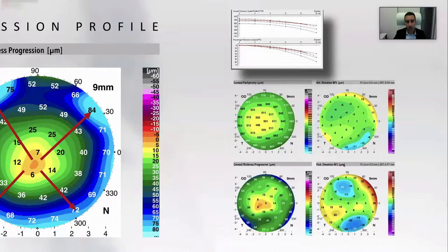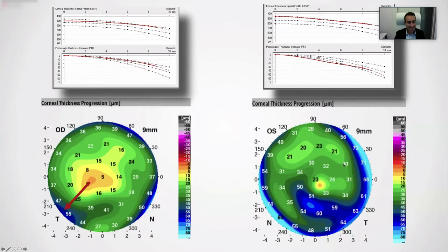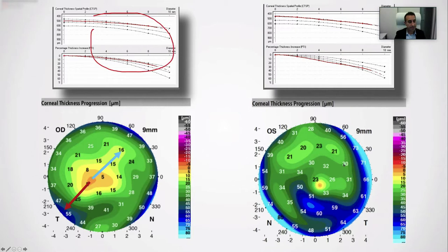Looking back at the same case, we see the Belin-Ambrósio Thickness Progression above, and the visual map below. In the right eye — the minimally involved one — you can easily see that the infratemporal thickness progression is much faster than the supranasal. This is hardly picked up by traditional thickness progression reports because they average out all the meridians and dilute these findings. Furthermore, they measure only thickness progression and not speed progression, so they may not pick up very early changes or tendencies.